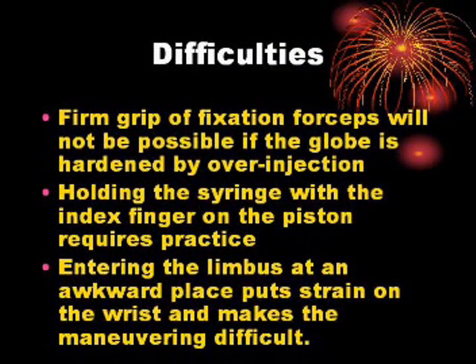Difficulties: A firm grip of the fixation forceps will not be possible if the globe is hardened by over-injection. Holding the syringe with the index finger on the piston requires practice. Entering the limbus at an awkward place puts strain on the wrist and makes maneuvering difficult.